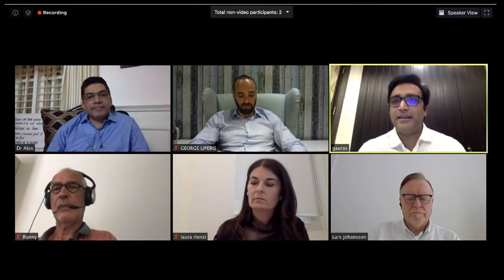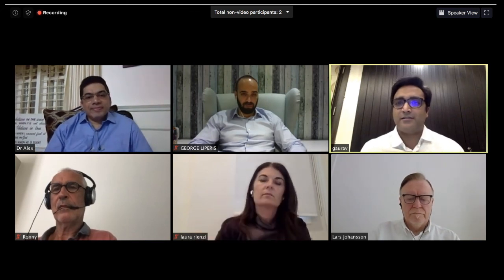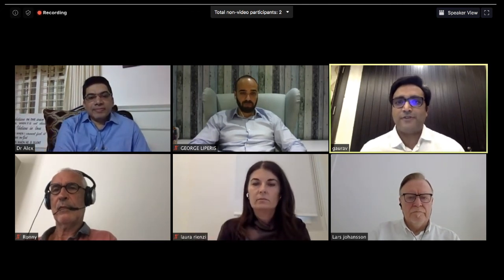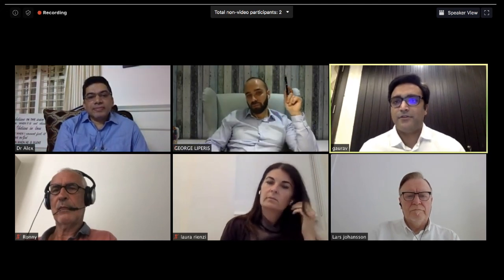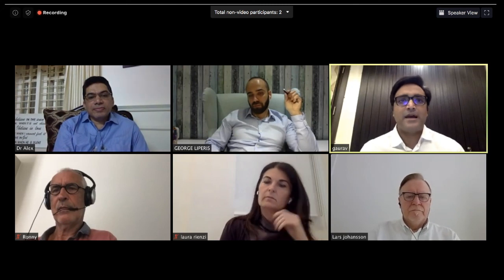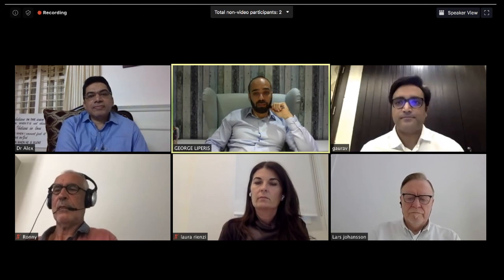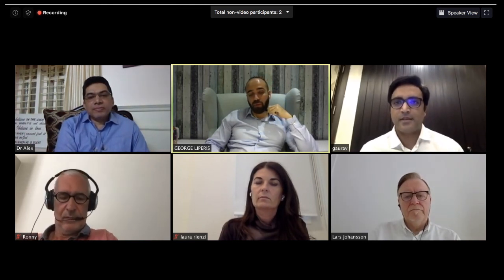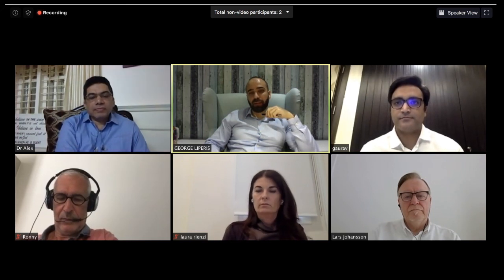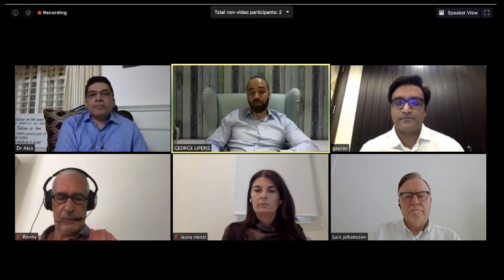There's additional delay in culture media availability, and these are all short expiry items. So how to address this problem? Yeah, George. I mean, we have experienced a lot of delays, especially with the courier services and postal services. So it's important that your media provider can guarantee that there is a temperature logger packed within the media, so that you can assure that there was no temperature variation during shipment.